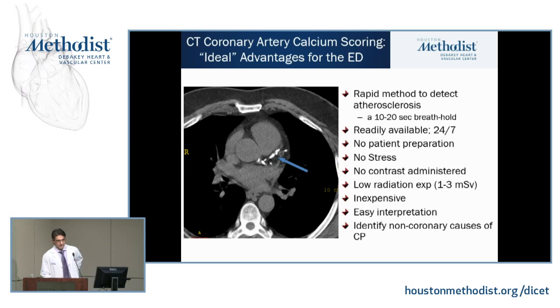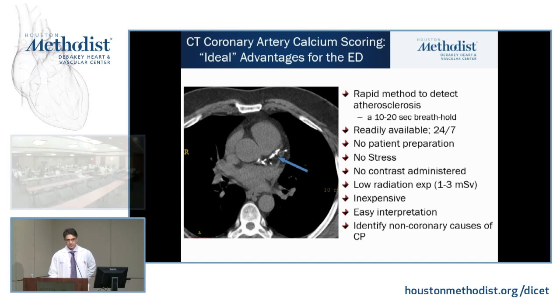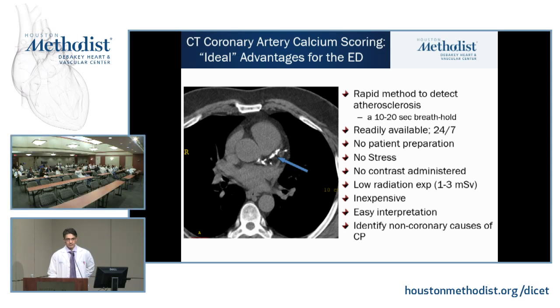Quick question. So the calcium score is asymptomatic, 0, and what else? What's the next big step? Is it 0 to 400, 0 to 100? Repeat the question. Sure. I think Steve is asking what are the ranges of the calcium scoring.